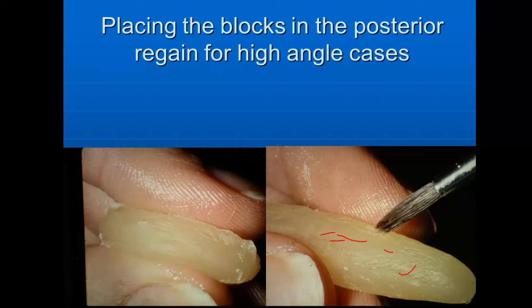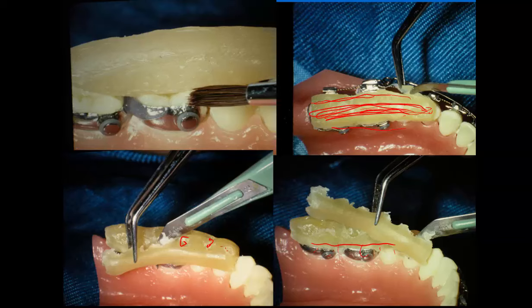Now this material is kind of tooth colored, and you'd pat out a little wedge of it that would actually fit over your teeth, and I'll show that again here in another view. We first etch the surface of these teeth before you stick this on. Just etch it, wash and dry that, and then take this liquid in the little brown bottle and paint it on top of these etched teeth.